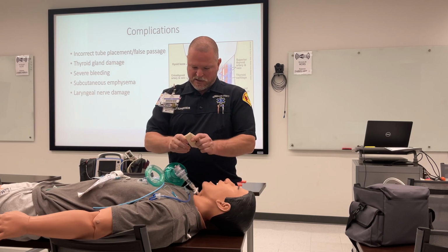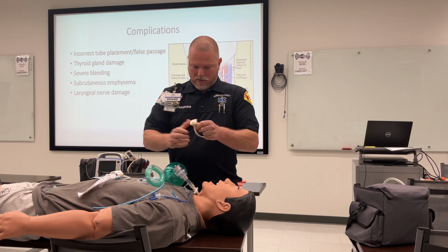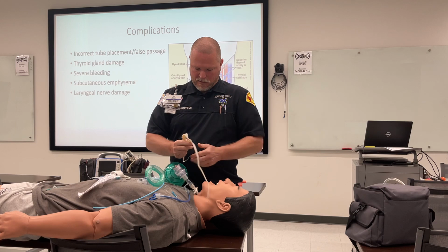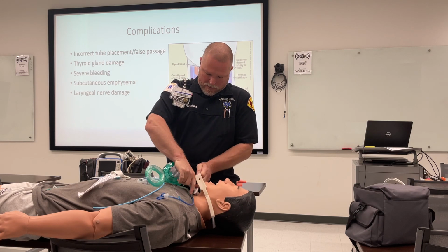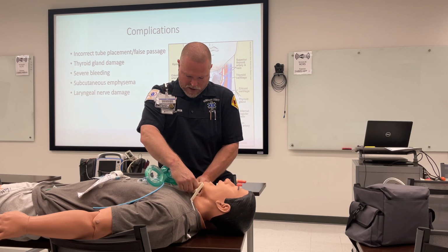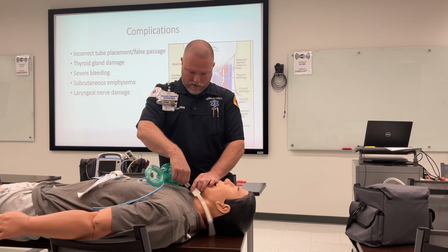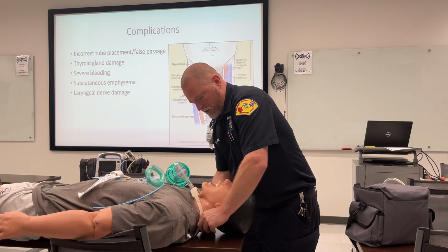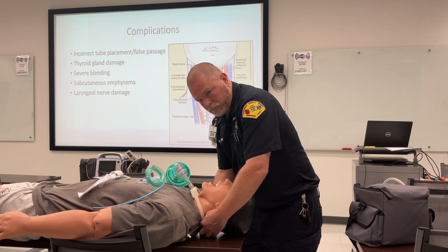And all it does is simply goes over the hole. Somebody will have to maintain holding the tube in place, making sure it's not gonna come out. And then it just simply wraps around the neck and secures back on itself with Velcro.